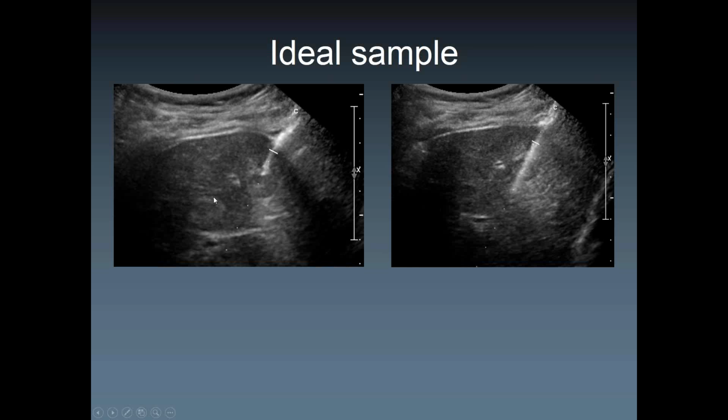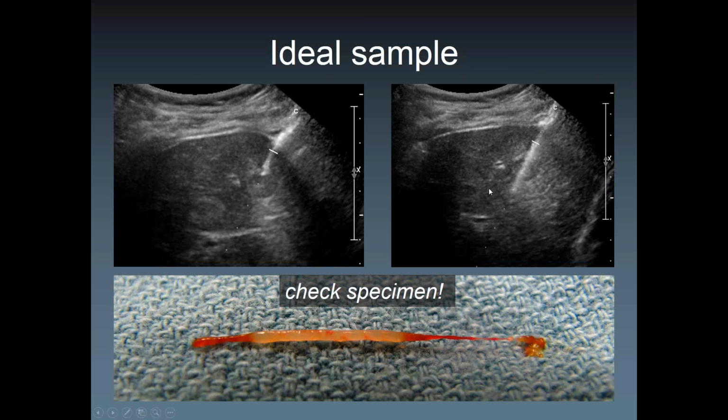And you biopsy basically from here to there, all the way to the target. So the distal tip, remember distal 5 millimeters, would be in here. You may just carry a little bit of organ tissue rather than target tissue, but part of it would also be just the biopsy device with no tissue. Then you carry some tissue from here, and then you get some tissue from the proximal end. The sample would look like that.